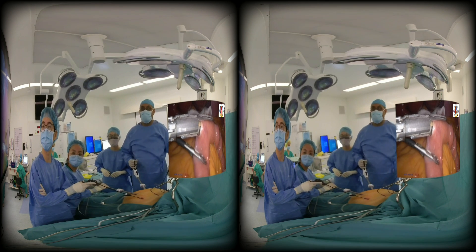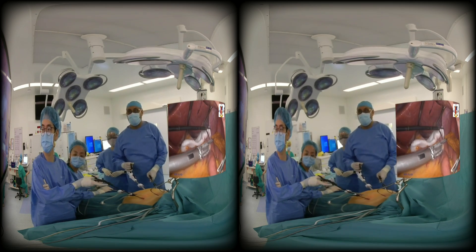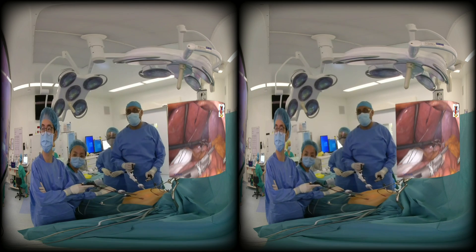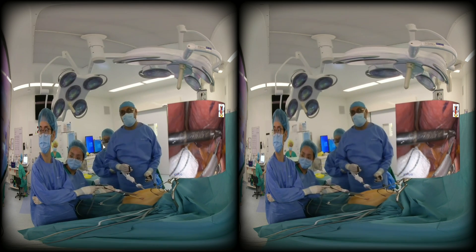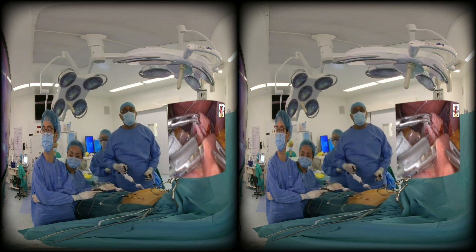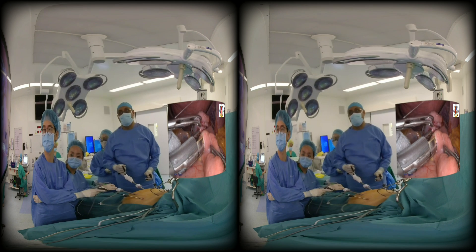After making the enterotomy, I use a 30-millimeter articulated stapler and bring this up in antecolic, antegastric fashion. If it's sometimes shorter and doesn't reach, I may go retro-gastric, but I have hardly done that — only one or two times. I will make an anastomosis that is about 1.5 to 2 centimeters. You can see the stapler is 2 centimeters and we close it at that.